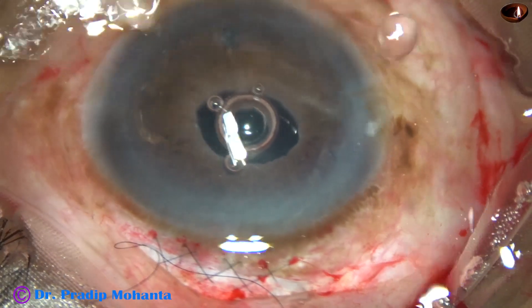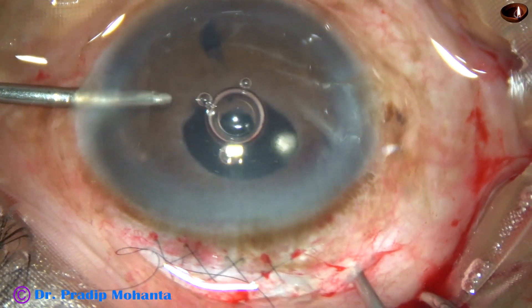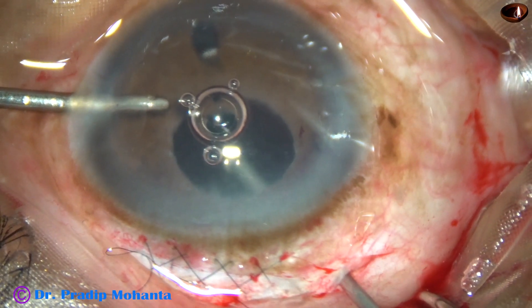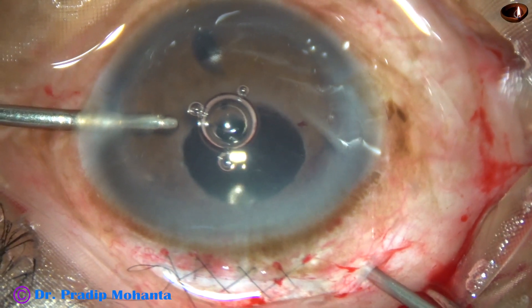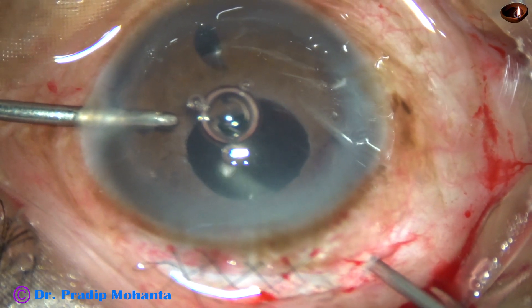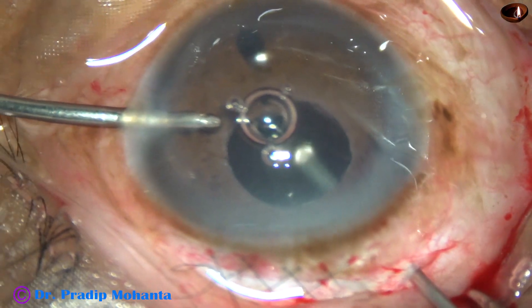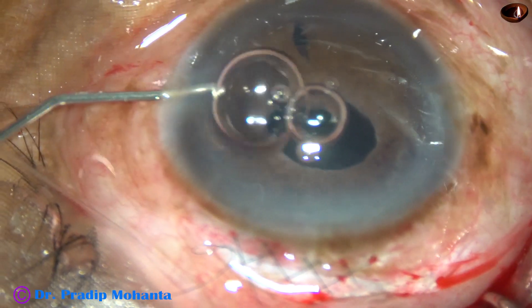And now I do some more anterior vitrectomy to remove the triamcinolone acetonide molecules, because in some patients intraocular pressure rises to a very high level because of triamcinolone acetonide. So I'm going to do some more vitrectomy. This pars plana sclerotomy is very useful to remove a little bit of vitreous to form the anterior chamber, and later on to remove the triamcinolone acetonide molecules.